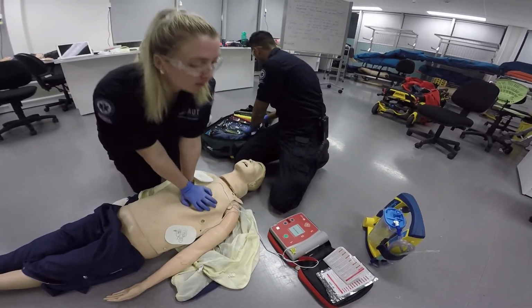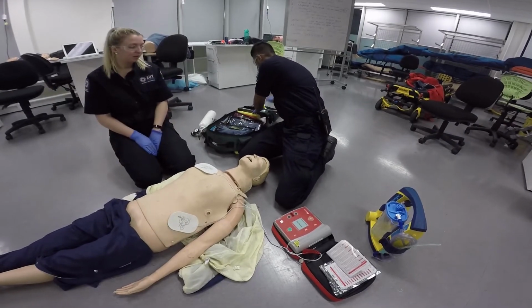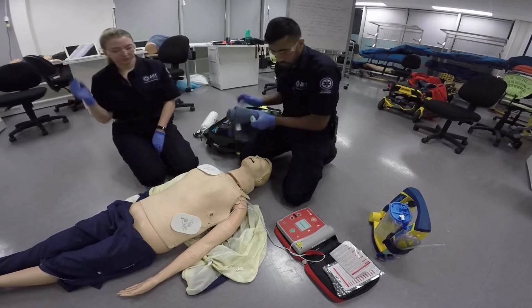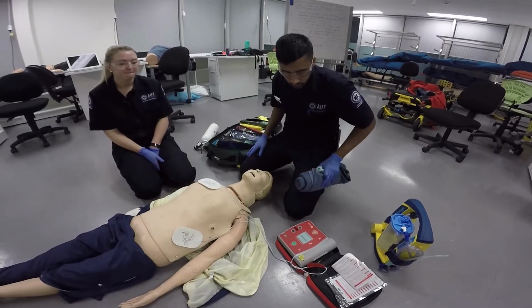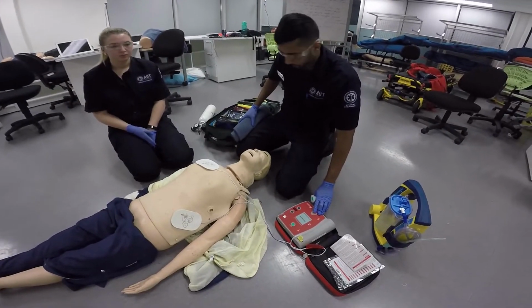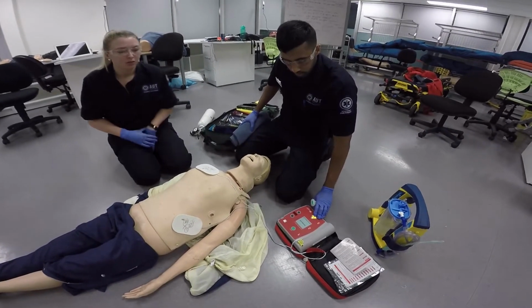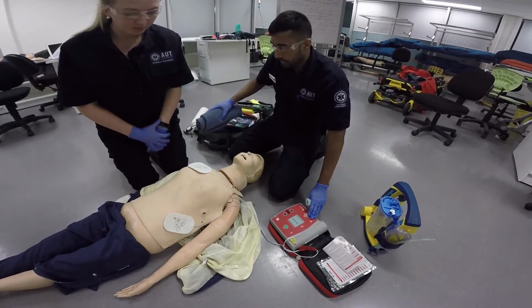Analyzing heart rhythm. Do not touch the patient. Shock advised. Alright, shock advised. Charging. Stay clear of the patient. Deliver shock. Alright, shocking now. Shock delivered. Alright, back in compressions, please, Shawnee.